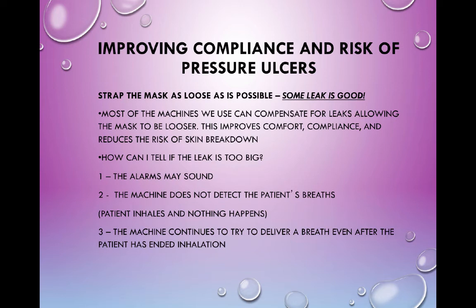We want that loose because if they hit the point where they start to get a sore that they can't wear it at all, we're kind of up the creek without a paddle. We got to intubate that patient. So we want to make them loose. The software can compensate for like 40 liters of flow. That's impressive. And then if you look at some of the masks, if we strap them too tight, we're almost bypassing what some of the design is.